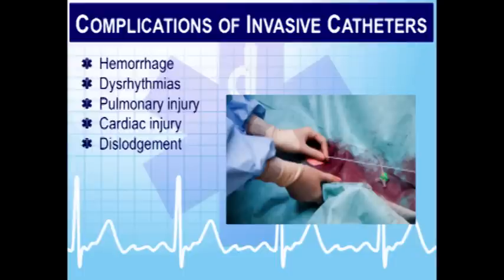Putting a Swan-Ganz catheter through the patient's heart can actually cause a right bundle branch block on the EKG. So if somebody already has a bifascicular block on the left side, are you with me? You know what a bifascicular block is? And now I put a Swan-Ganz catheter in, and it causes their right bundle branch block to occur, that patient's now in complete heart block because I put this catheter in their body. All right? Bifascicular block is a contraindication to a Swan-Ganz catheter.